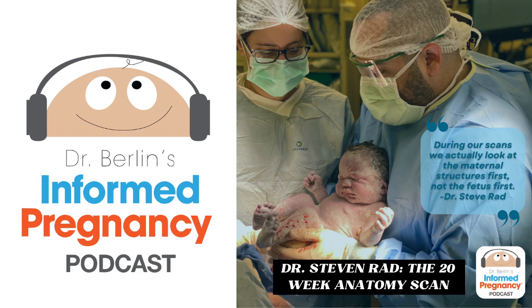What's the difference between 2D, 3D, and 4D machines? The majority of the ultrasounds we do for the fetal anatomy, and in general, use 2D ultrasound. Those are the black and white images, the traditional ultrasound you see, looking at the ultrasound in 2 dimensions. 3D ultrasound looks at 3 different planes. Let's say you have a ball or a brick. The probe will look at the ball or brick from the top, from the side, and from the middle. It will look at the image in 3 different planes, what we call sagittal, coronal, and axial.